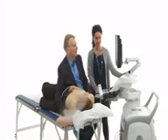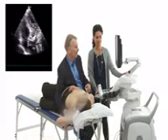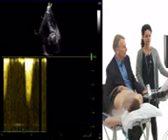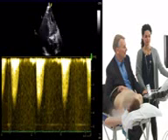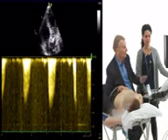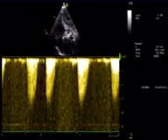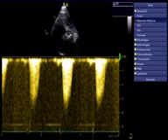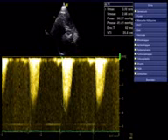But I would not rely only on the morphology. I would rely more on the continuous wave Doppler that we place through the aortic valve. And we do that in a 5-chamber view, ideally, so that we are better oriented to the flow of blood through the stenotic valve, so that the septum is usually slanted a little bit the way you have it in our view right here. And then you put the continuous wave Doppler through, and then you would simply just trace the curve. And at that time, you would not only get the mean gradient, but also the maximal gradient.